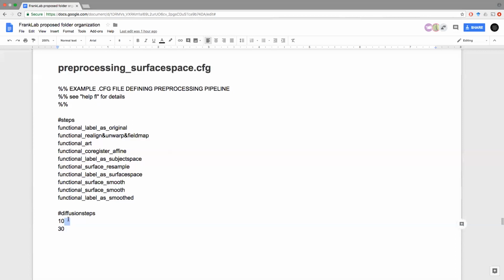So typically, I would say use the full level of smoothing. That's the optimal level for the typical, subtle questions we ask, and only use unsmoothed or minimally smoothed data when you have too much power and you don't care about sensitivity that much, and you care more about the specificity of the things you're looking at.